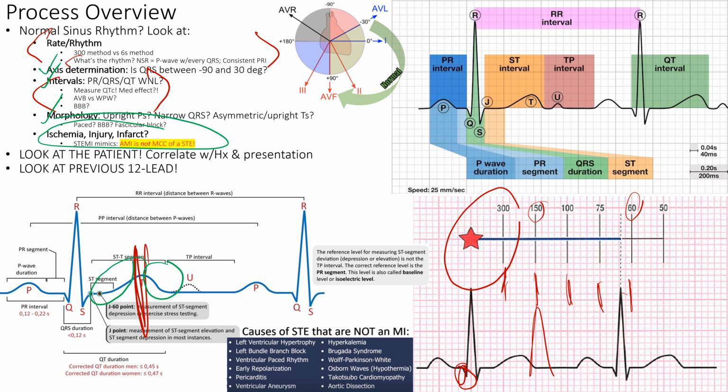The most common cause of ST elevation is not MIs. It's actually number 8 on the list, right? It's not even up there. So these are causes of ST elevation that is not an MI, right? You got left ventricular hypertrophy, you got a left bundle branch block, you got a paced rhythm, pericarditis causes ST elevation, you got early repolarization, which we'll mention briefly.